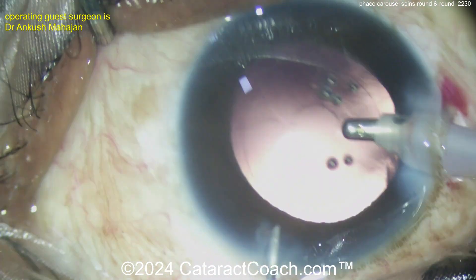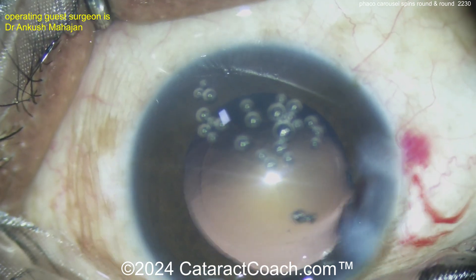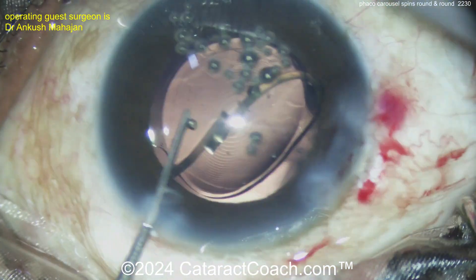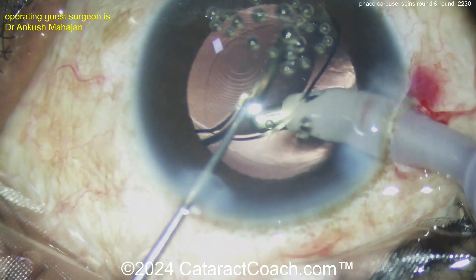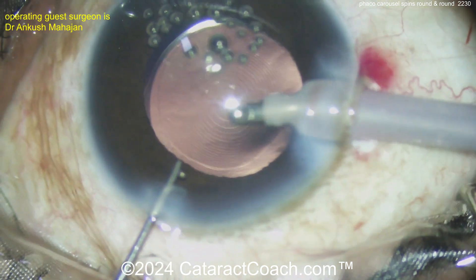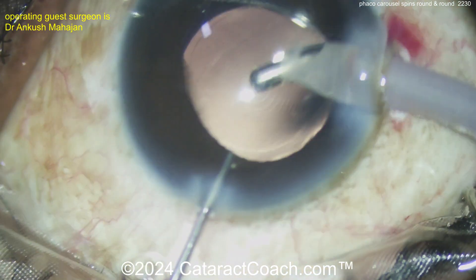If you had a really dense cataract, you'd operate very differently than with a very soft cataract. For a case like this, I would have probably just tilted the nucleus out of the bag and chopped it in half, then emulsified each half very quickly. Now it looks like a trifocal or multifocal lens going inside the eye — you can see the diffractive rings. Get those haptics opened up in the capsular bag, get the lens beautifully centered, and this patient has a very nice outcome.